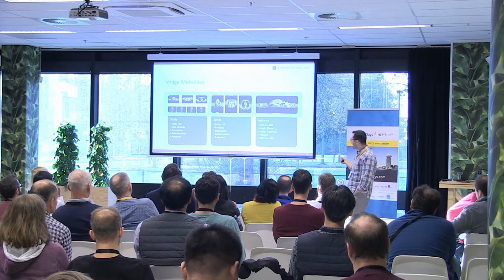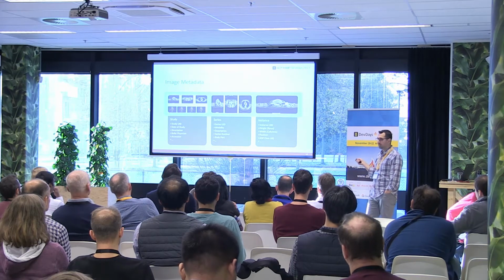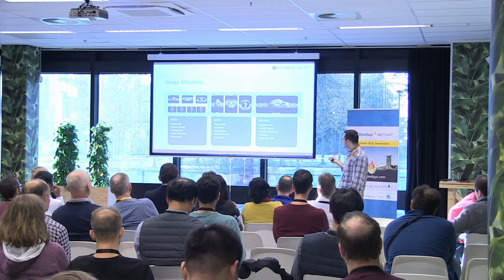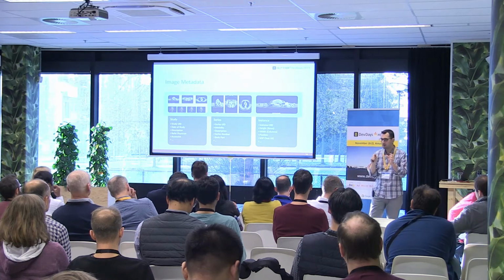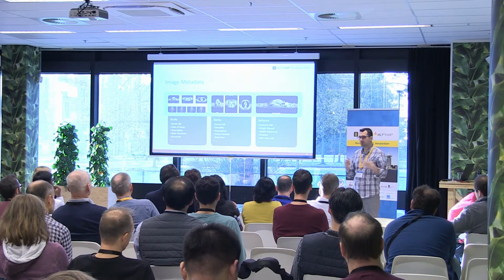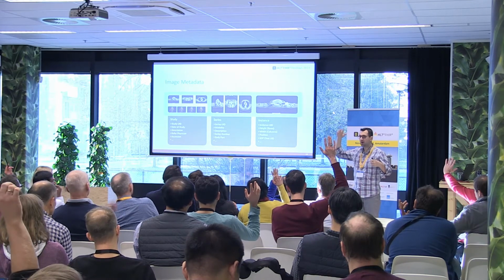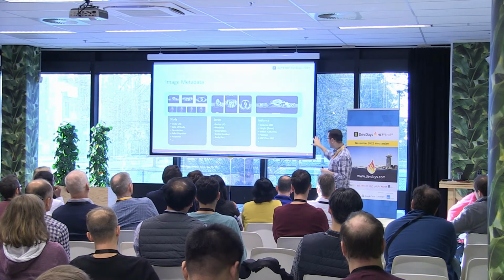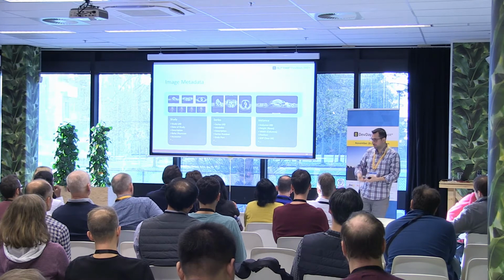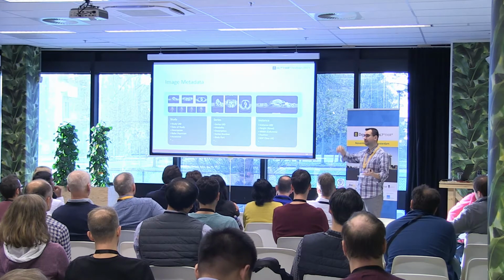For an instance, we have the unique identifier one more time, height and width, and in DICOM jargon it's actually called rows and columns. And then of course you have the position, so this is a numeric position of the exact dimensions within the patient's body where it's taken. So if any of you have seen 3D reconstruction images, can I get a show of hands? Has anybody seen these? Okay, so that's how these 3D reconstructions can happen. You can actually take DICOM images, and from the metadata, you identify the exact location and the organs that are being scanned. And all the colors and 3D models are actually built from this information.